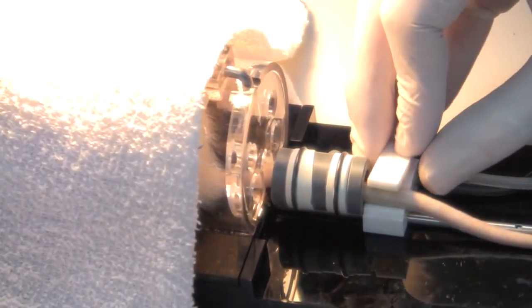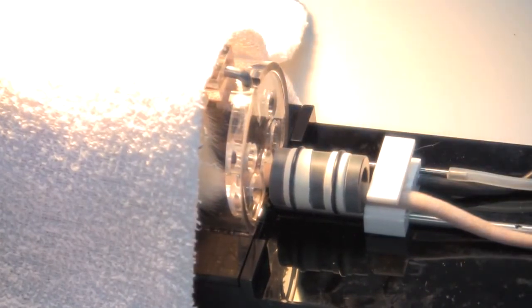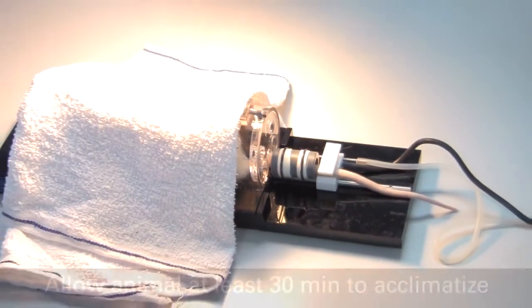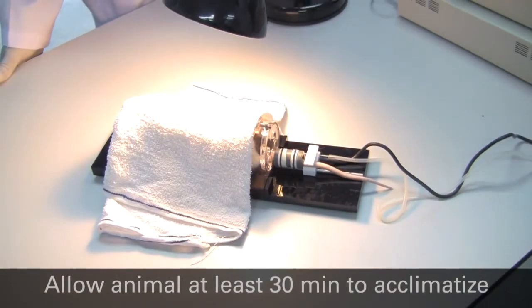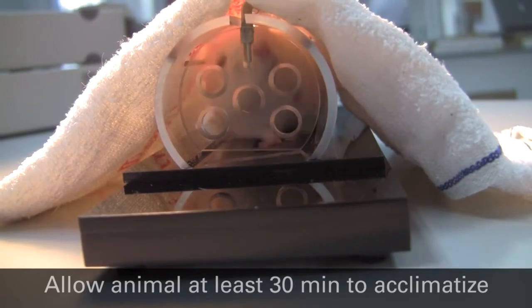Once secured, ensure that the pulse transducer is not in contact with the tail cuff, as vibrations from the cuff may affect the pulse signal. It is recommended that the subject is allowed to acclimatise to its new surroundings for at least 30 minutes prior to acquiring any data.